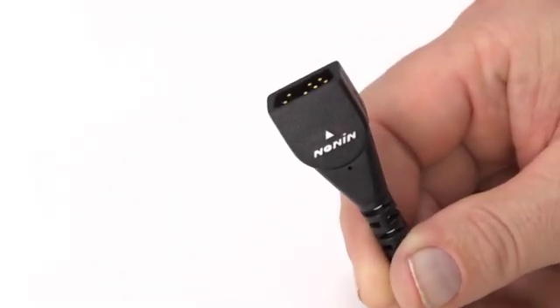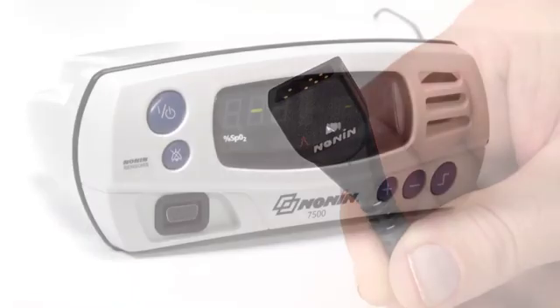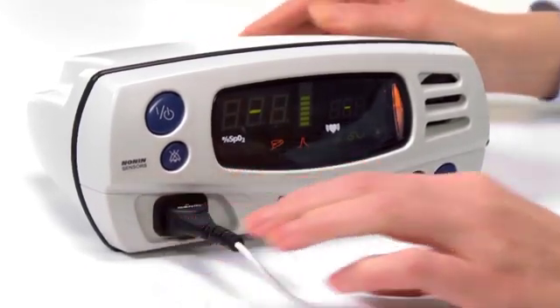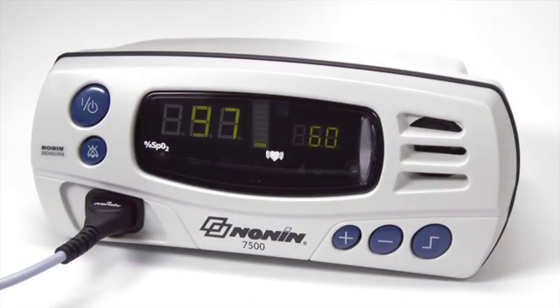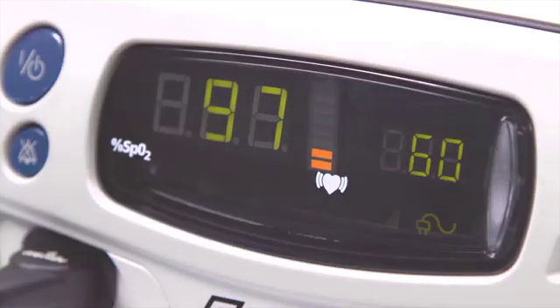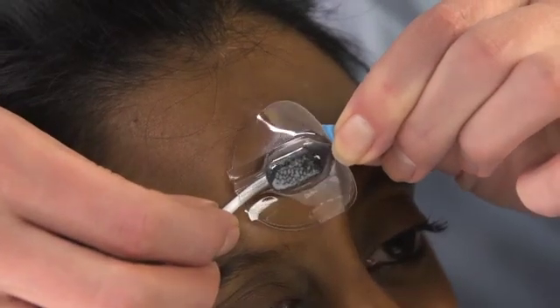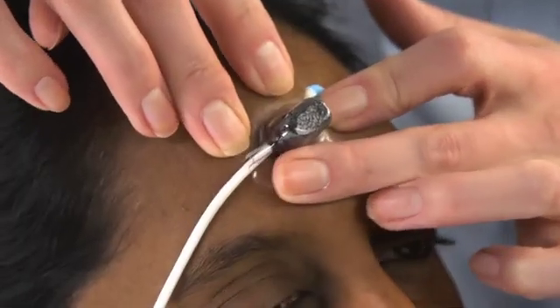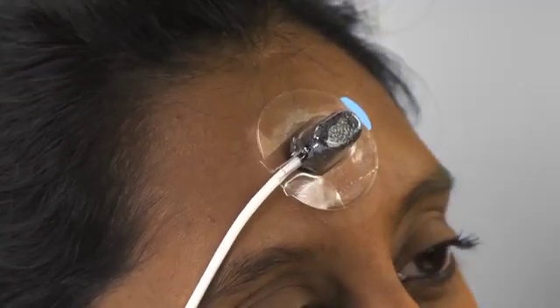Now you're ready to use the NONN pulse oximeter to measure oxygen saturation and pulse rate. NONN pulse oximeters have a pulse signal quality display that measures the sensor signal. If the signal is low, the emitter and detector may not be in proper position. Reposition the sensor to see if a stronger signal can be obtained. If repositioning does not increase the signal quality, try another area on the forehead.